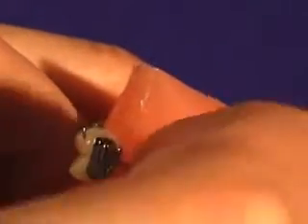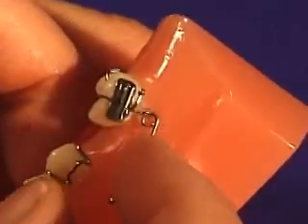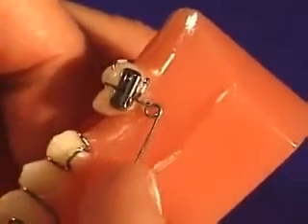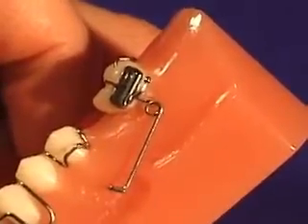If you are inexperienced with this appliance, you may want to place the spring into the bracket prior to cementation. The wire is preloaded and should be placed through the hole and pressed all the way up as far as possible.